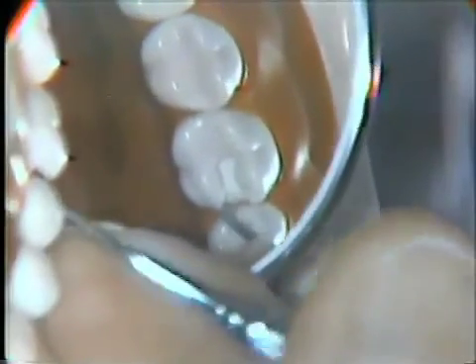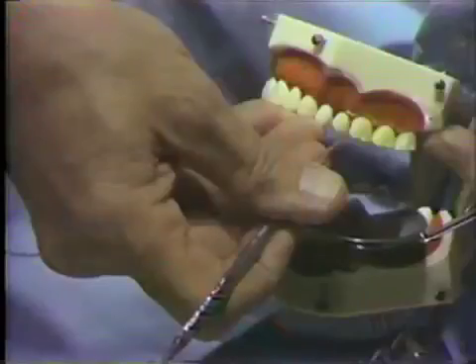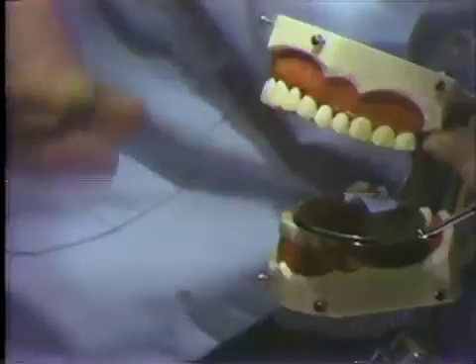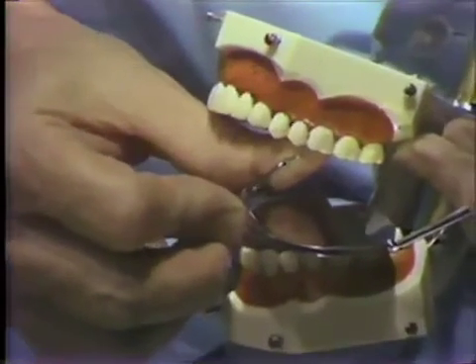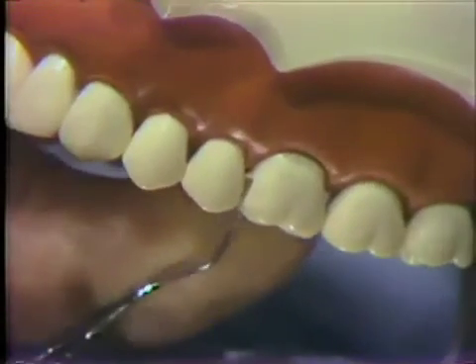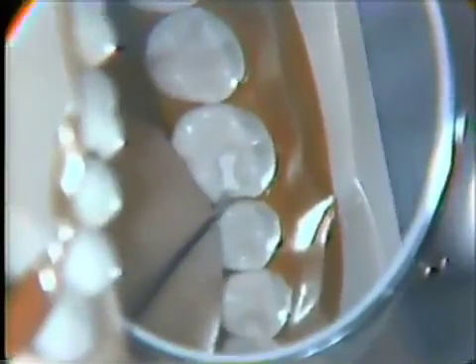The lateral scraping completes the section relating to lingual proximal cervical utilizing the inverted pen grasp. Switching the same instrument to the palm thumb grasp and applying the blade to the buccal proximal wall, we would effect the same type of refining action — planing the wall in a cervical direction, sharpening the internal line angles, and a lateral scraping action to complete the refinement across the cervical floor.